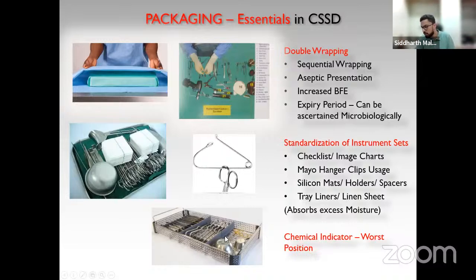There are separators also available where instruments can be placed relatively well. So in this kind of a case, the sterilization is going to be beautifully well. It is going to be excellent. There are no chances of sterilization not happening properly if you have a good autoclave. And if you also observe over here, a small linen piece has been placed below. That is for absorbing your excess moisture.